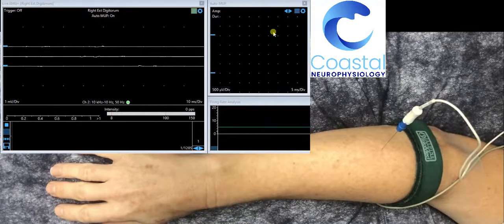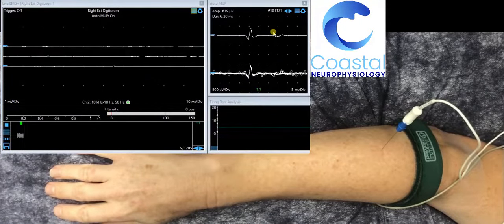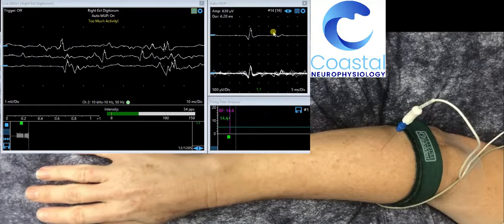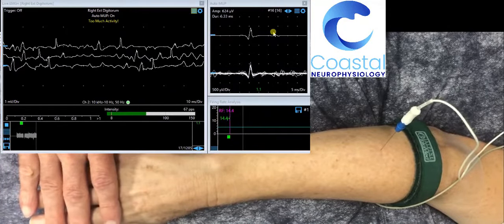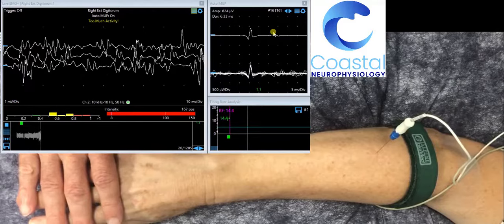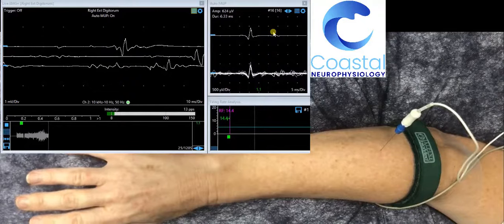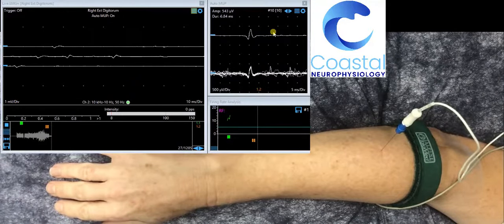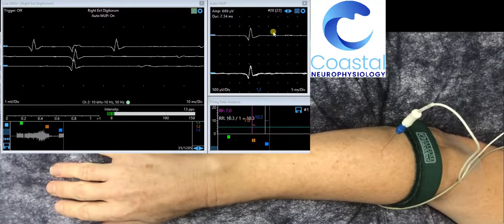When we are analysing these signals, we record at both low levels of activation, and often this requires a little bit of resistance placed against the body part. As the patient then relaxes, it quietens back down. This electrical signal is what we analyse when we look at EMG, and it tells us the electrical signature of the nerve supply and the muscle.